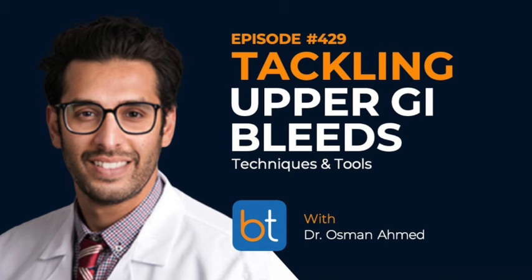Yeah. Actually, I'd be curious to hear what you think, but my practice has evolved a little bit. I was trained primarily on detachable coils, and early in my practice was 100% detachable coils. I've now come into a practice that's a little bit more cost-conscious and has a lot more old-school faculty that I'm partners with, and so they've turned me on to pushable coils in the correct scenario. So I'm using a lot more of a combination of pushable and detachable coils. I think there is some value to fibers. Pushable coils are obviously fibered, and there are certain detachable coils that are also fibered. But I still say I'm primarily detachable with some pushable mixed in there.